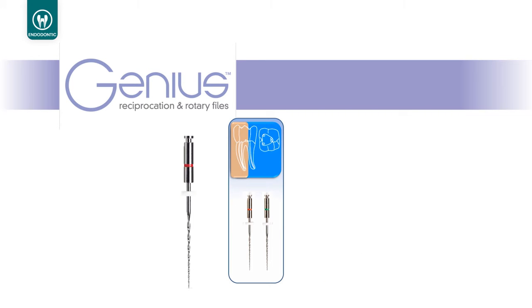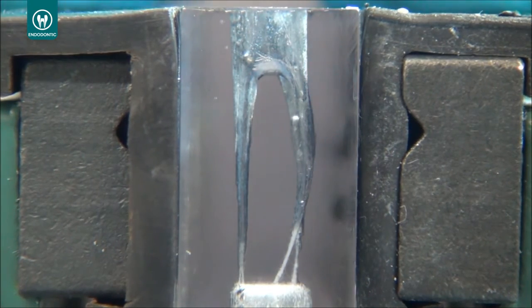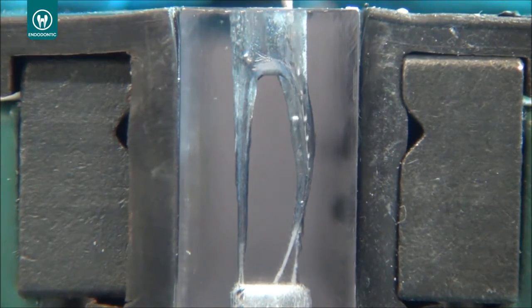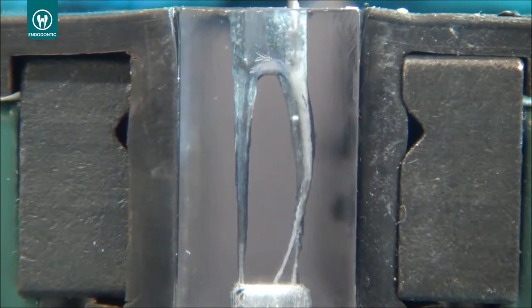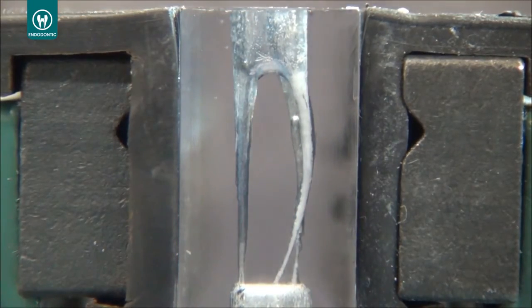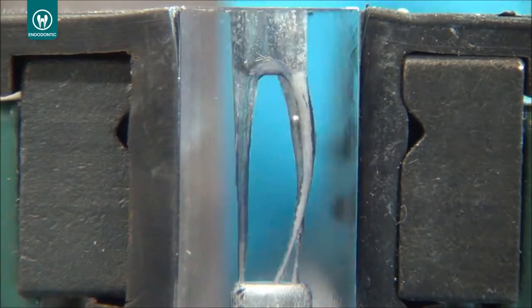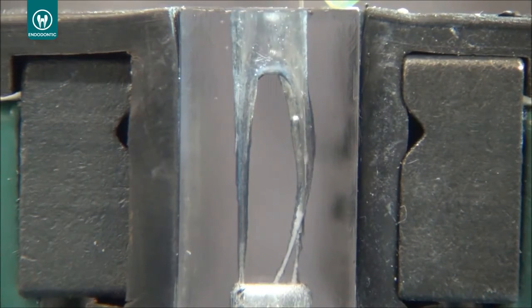So the 25/04 Genius file is an S cross-section file. It means that it cuts a lot. So you just put the file inside the canal, feel some resistance, go back a little bit, 0.5 to 1 millimeter, and then start with brushing movements towards the dentin walls and doing the instrumentation.